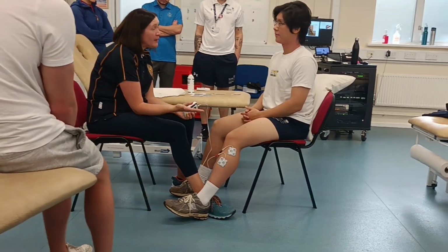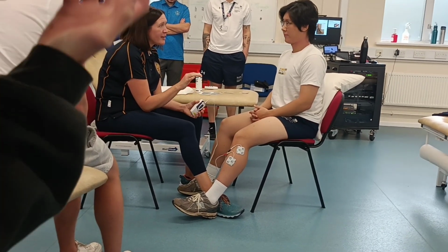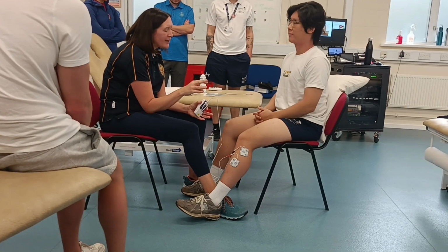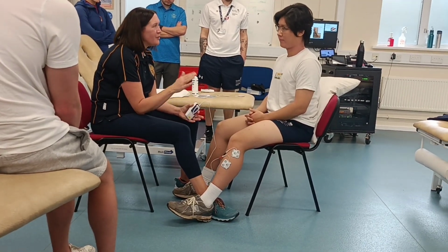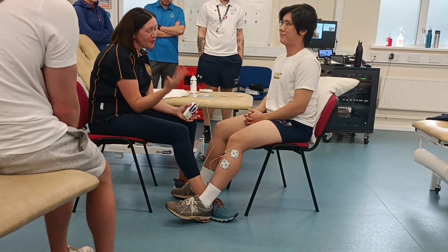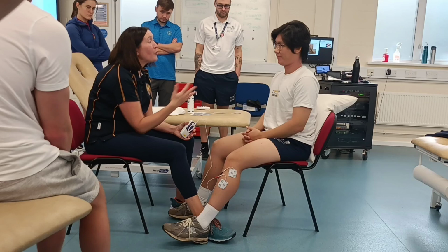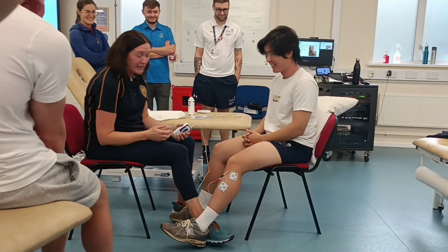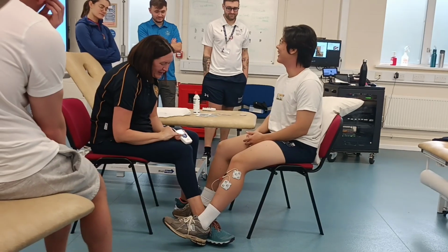It shouldn't be painful and it shouldn't be uncomfortable, but it will feel a little bit weird, like a bit of a buzzing, pins and needles feeling, and it feels weird because something is controlling your body that you can't control. Okay, but if it is uncomfortable, let me know, and then I can change things to make it more comfortable. You never know. Okay, so I'm just doing the plus button now.